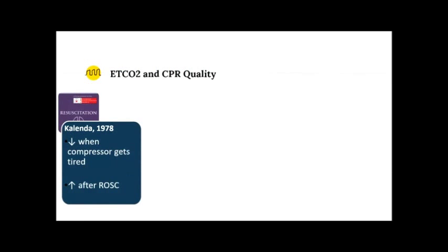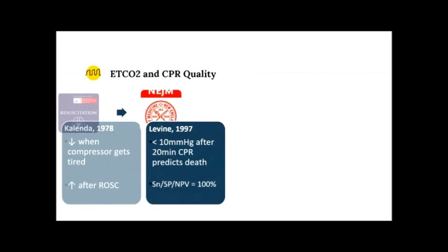There were about 20 years' worth of research in between, with numerous animal and human studies looking at this association between CO2 and CPR. And there was a seminal trial published in the New England Journal of Medicine in the late 90s that looked at the value of CO2. A CO2 less than 10 after 20 minutes of CPR was a strong predictor of death. In fact, they said there was a sensitivity, specificity, and negative predictive value of 100%.